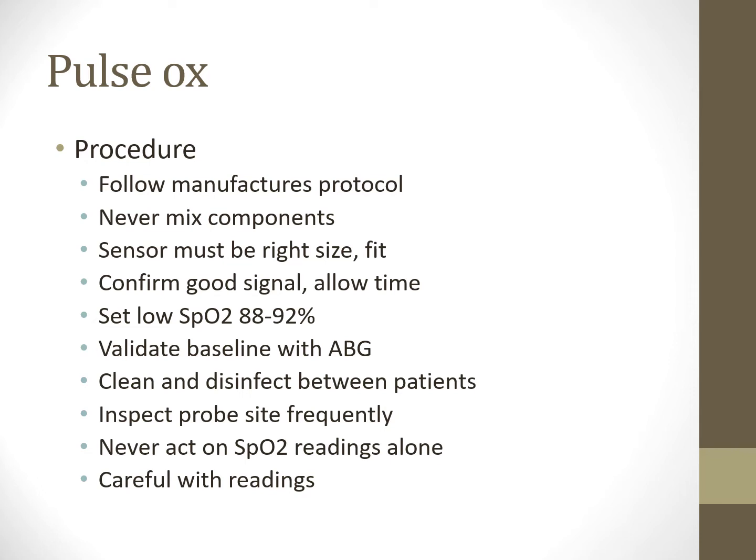Make sure if you're using the reusable pulse oxes or the finger pulse oxes, you're cleaning it in between patients. I guarantee you that you guys have all followed an RT out there or a different provider out there that has not wiped down their equipment in between use on patients. Please just do that. We had a lot of rooms where the patient had their own pulse ox in the room. They had their own vital sign machine in the room. So I would just use theirs. I had mine if I needed it, but most of the time I just use theirs that are in the room. Inspect the probe site frequently if they're on continuous pulse oximetry.